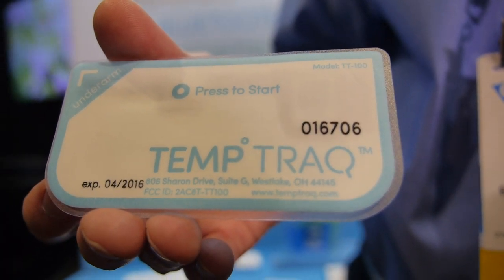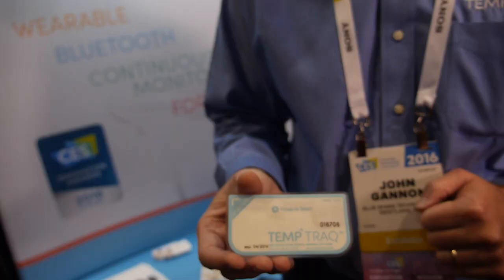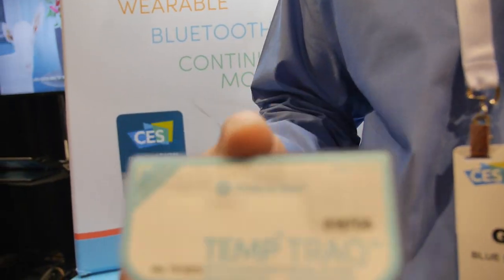So this is TempTrack. What's your company name? BlueSpark Technologies. So who are you? I'm John Gannon. I'm the CEO of BlueSpark Technologies. And what are you showing here? This is TempTrack.